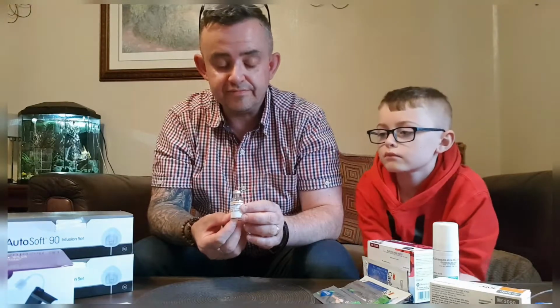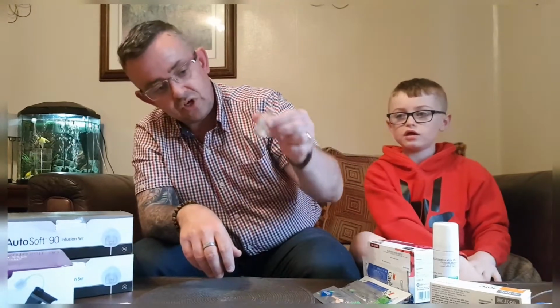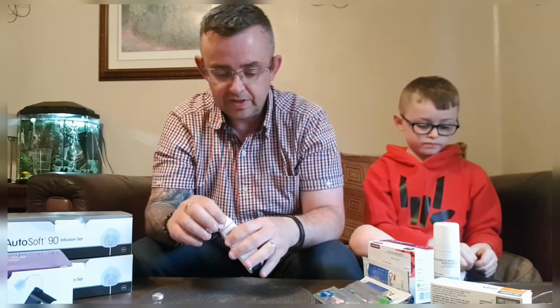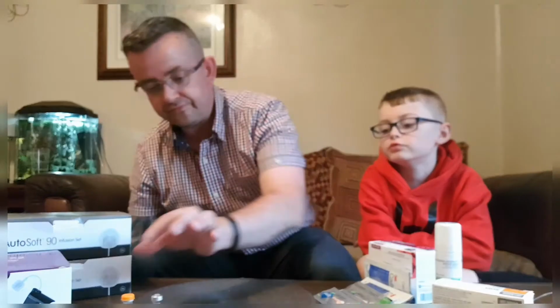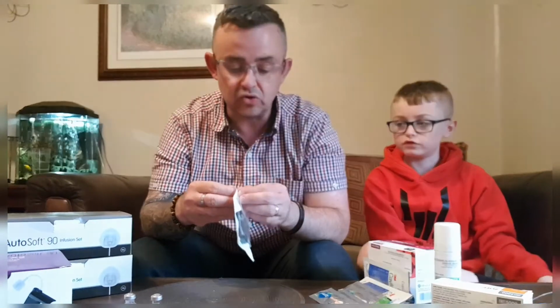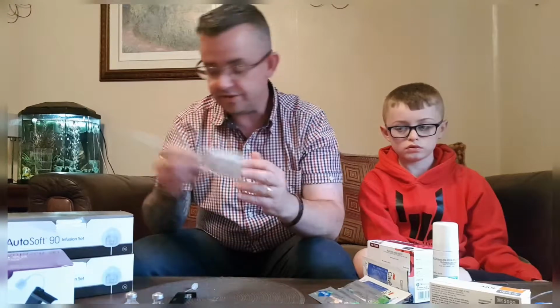I use Novorapid as a fast-acting insulin, and that's what I've been on since diagnosis. It's like a bottle with a cap on. This one's got a little bit left, so we will have to use a new one. I took those out of the fridge prior to recording. You have to keep them in the fridge, because if insulin gets too warm, it's no good. It won't work. So that's a new cartridge.